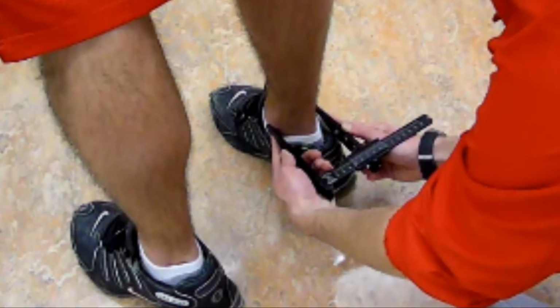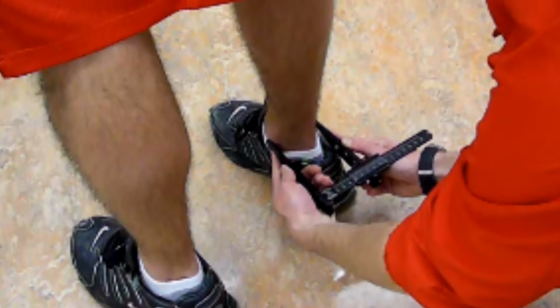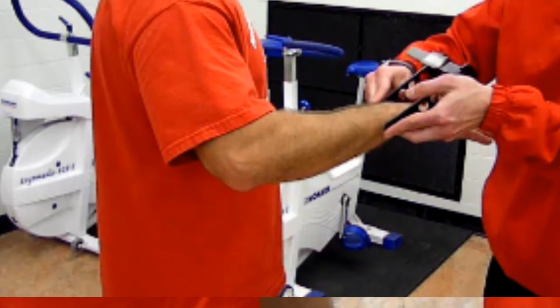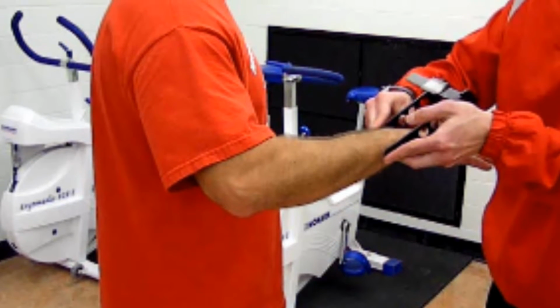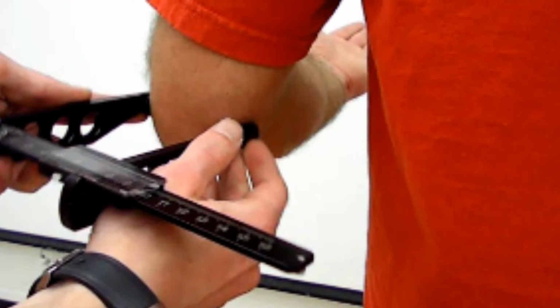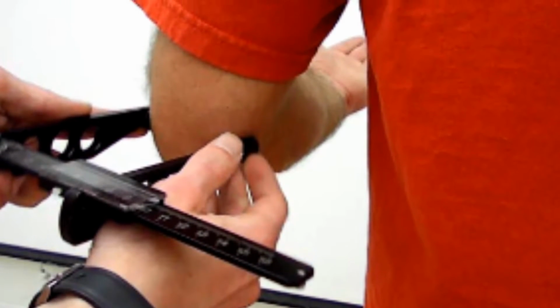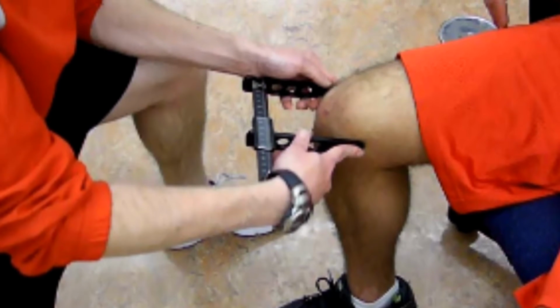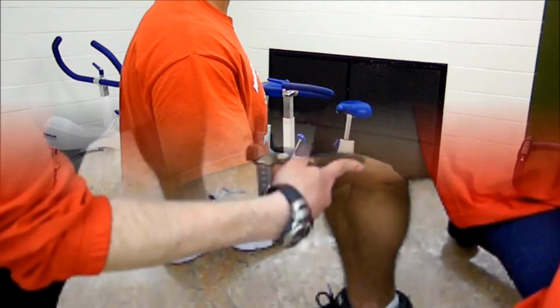When assessing body segments with a smaller girth, such as the ankle, wrist, or elbow, a small sliding caliper should be used as it has greater scale precision. Each location should be measured 2 or 3 times in a rotational order. The recorded values should be within 0.2 centimeters and the average of the measures ultimately recorded.